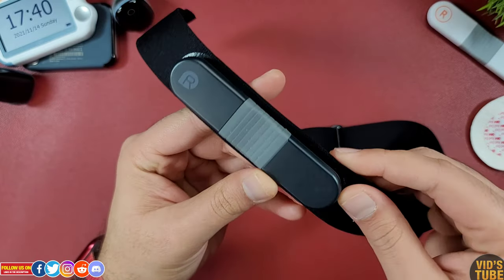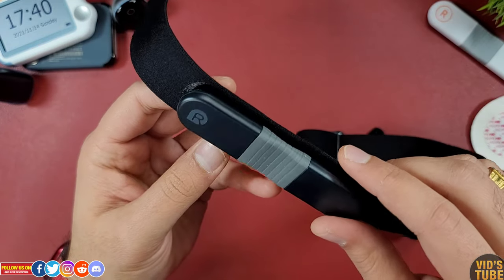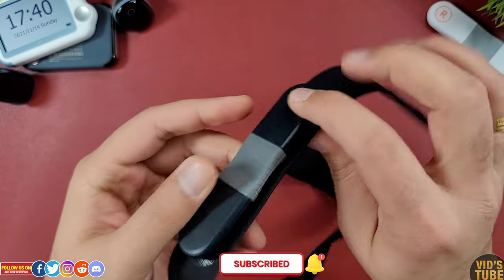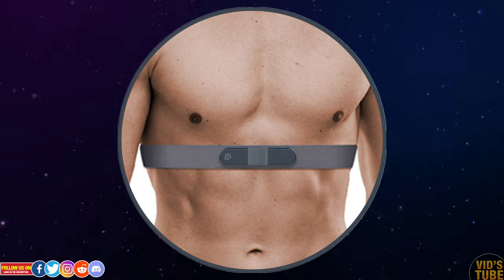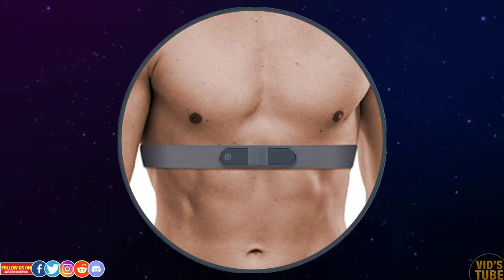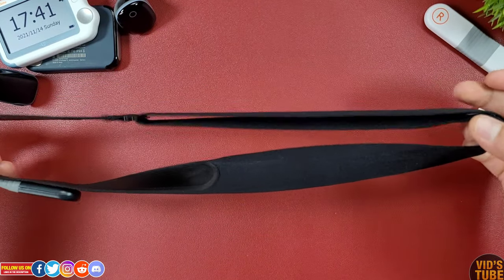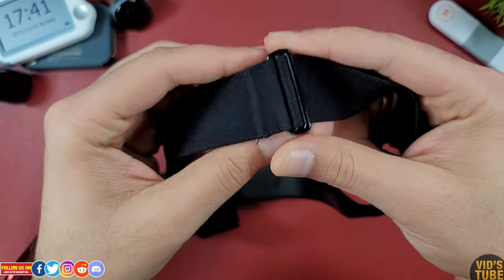This chest strap is machine washable, but make sure to detach the ECG electrode before washing. The ECG recorder is very easy to attach — make sure to place the right side on your right side or else the ECG graph will be inverted. Place the chest strap as shown in this image. To wrap it around your chest, you just slide the sleeve inside the hook attachment, which can be done with two hands very quickly. You can also adjust the strap length from the buckle.